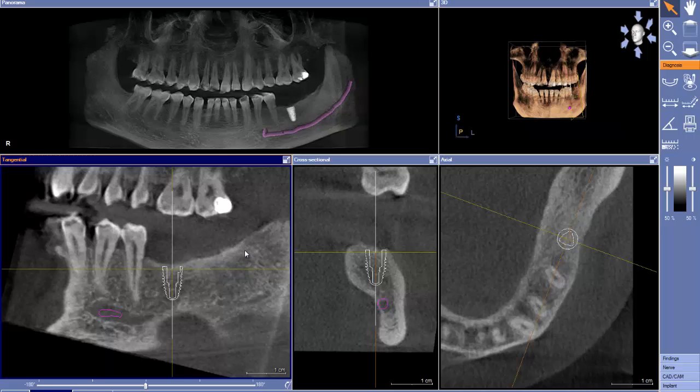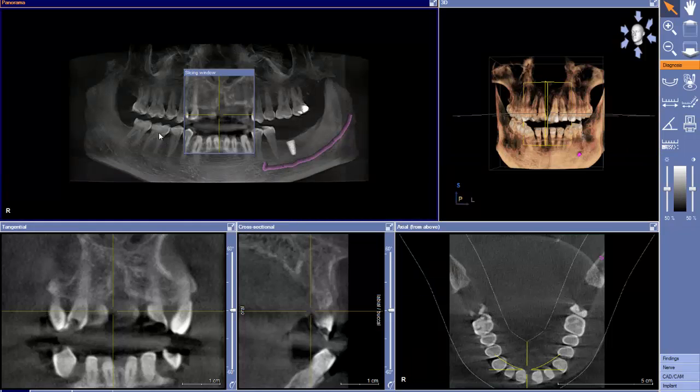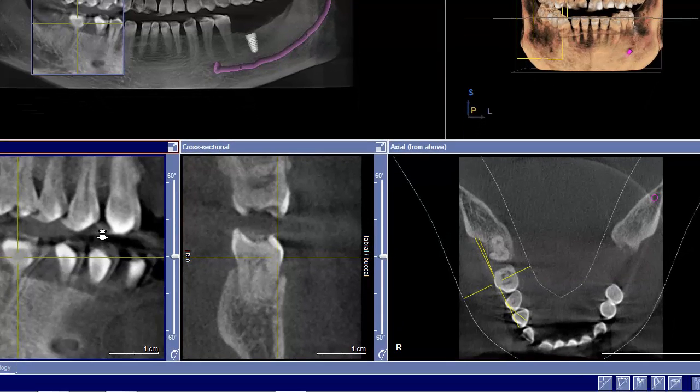The best way to know this is ideally with CEREC data, implant built into occlusion. The second best way would be a scan appliance with the barium sulfate tooth in there. The third best way would be to guess, which obviously we want to try to avoid. So let's address that, and let's take a look at another option to try to understand the size of a tooth that we can put here.